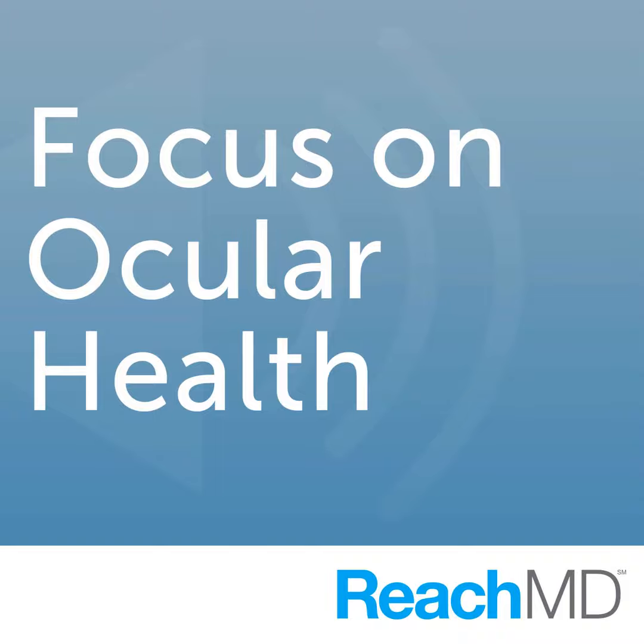Correct. And it then shows where the fluid is located, whether it's underneath the layers of the retina or the choroid. Yes, it shows where the fluid is located, and you can actually take very precise measurements in terms of microns of elevation and thickness of the retina. So then you can use that information to track how successful you are in terms of your treatment.